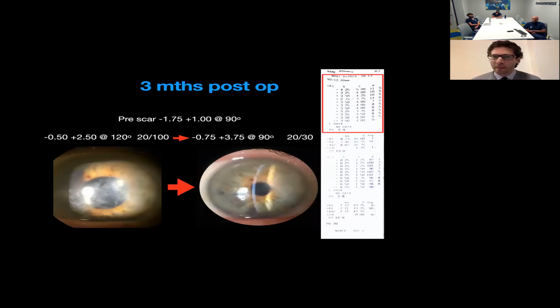So when you're doing that and then you see a homogeneous color, is that where you stop? Or do you ride through the entire 100 microns? I actually go until the end. I do everything that I have planned. There are some surgeons that like to take the patient to slit lamp to see if the fibrosis is already gone, to see if they have to continue with the PTK. But I like to do the whole treatment.